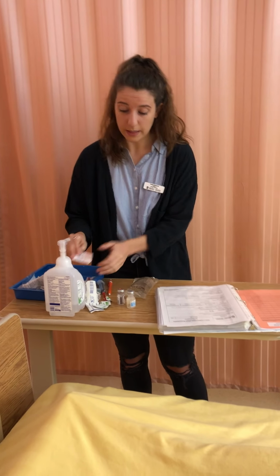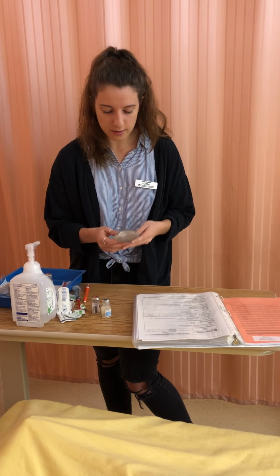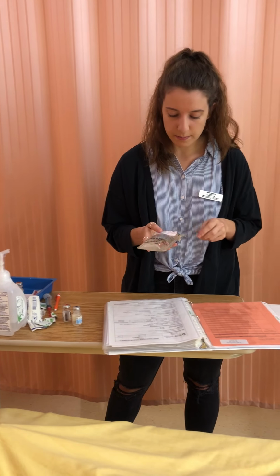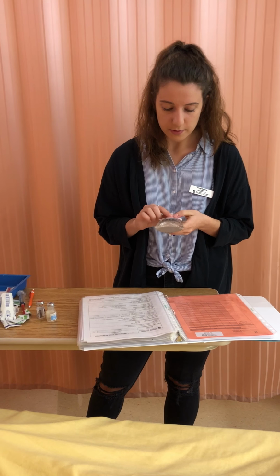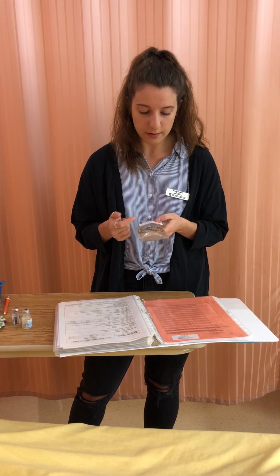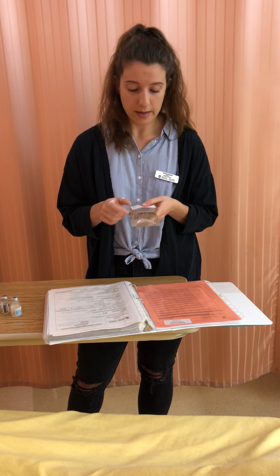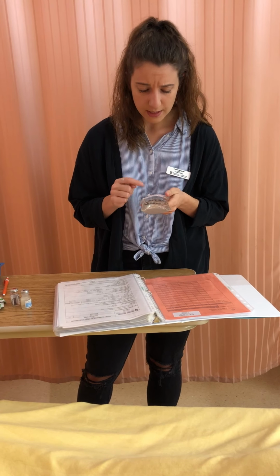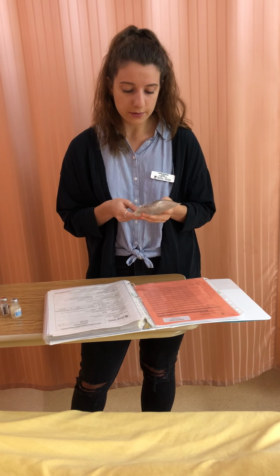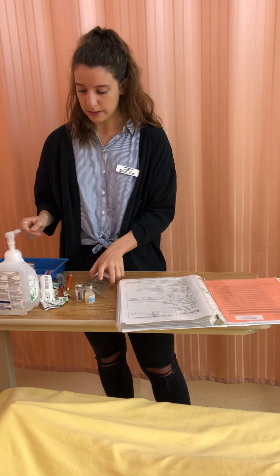And I'm going to put my label that I previously made over top, not covering any important information. So my label has the patient's name, it has the drug on it, which is Zithromax, the dose 400 milligrams, and my volume that I pulled out, 4 milliliters, but there's 254 milliliters in the bag now, for a final concentration of 1.6 milligrams per mL. I have the date, my signature, and the flow rate, which is 254 milliliters an hour. So now I'm going to get ready and go to the bedside.